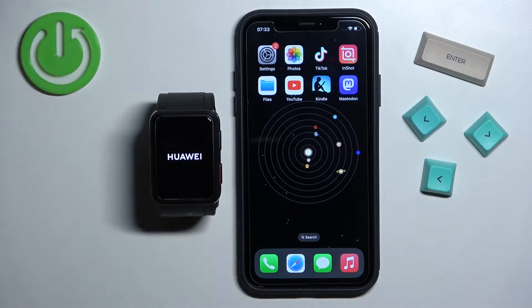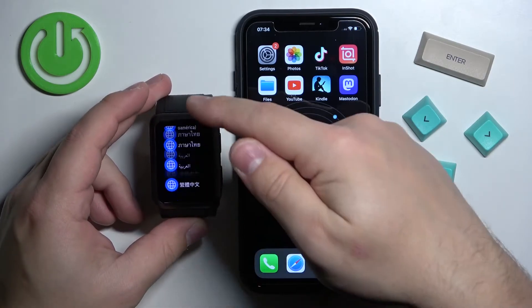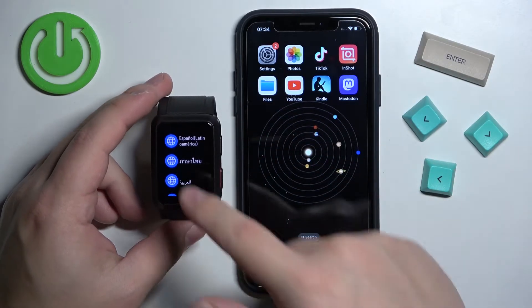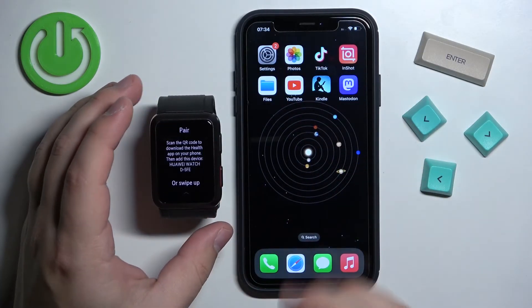Once you see the logo you can release the button and wait until the watch turns on. After the watch turns on you should see the list of languages on the screen. You can scroll through this list by swiping up and down on the screen. Now find the language you like to use and tap on it to select it. I'm going to select English UK.